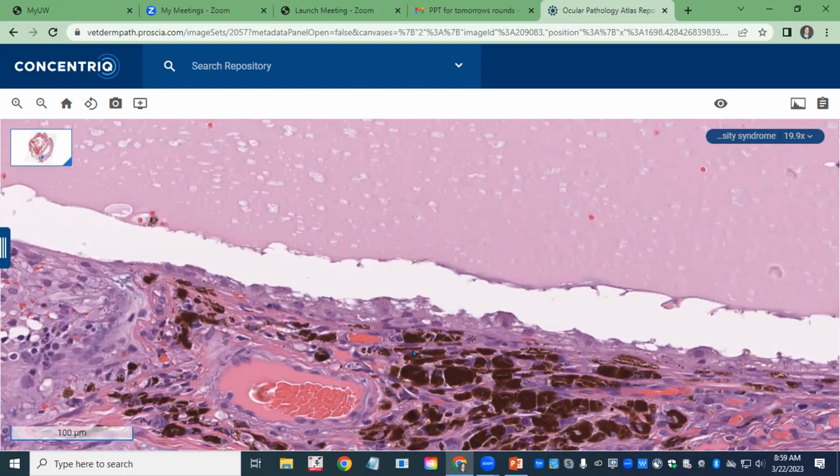So you have to be a little bit careful with that. That's why it's nice to be able to look at the choroidal blood vessels in a nice case like this, and say, oh yeah, that serum is way too pink. And once again, that comes with looking at a lot of cases. And obviously this one came with a helpful history. So that was obviously very helpful for making this diagnosis. And with that, I'm done.